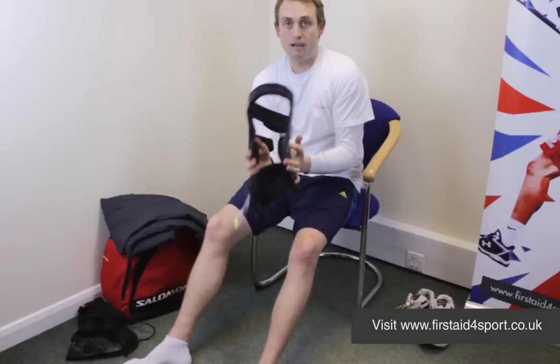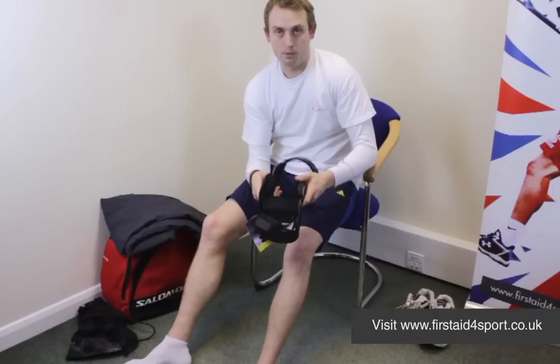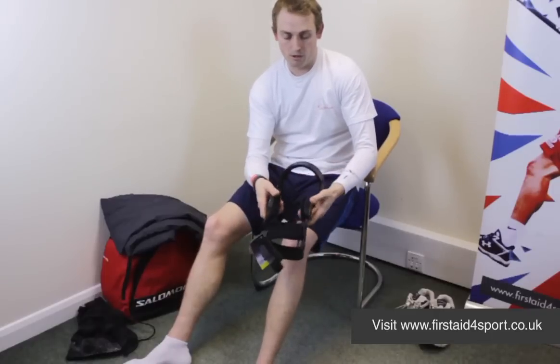You have to choose left or right knee — they don't fit both. It's a very simple brace to put on, but it's really important that you get it on right.